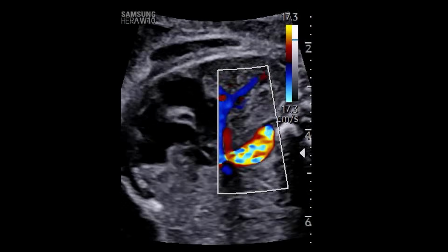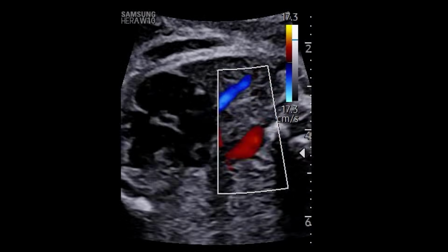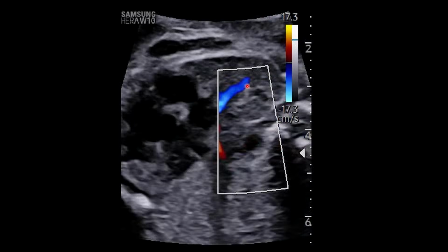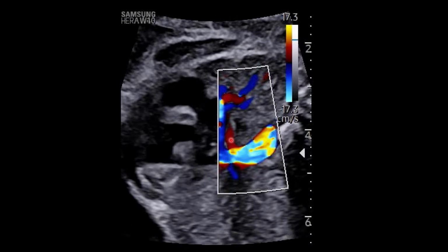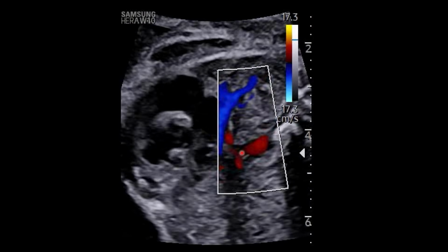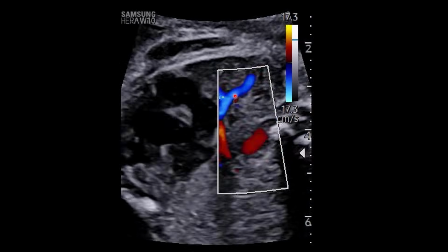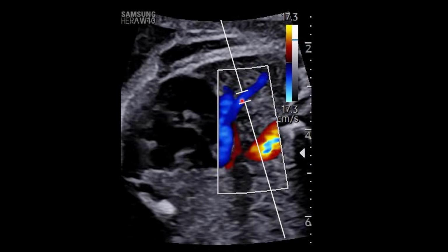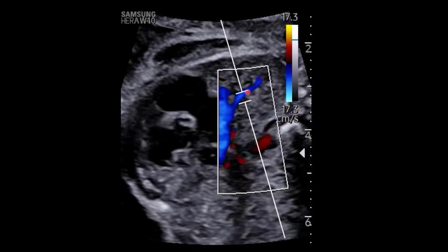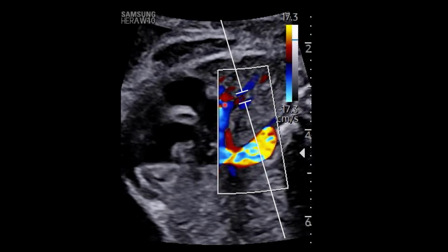Another method is the pulmonary vein, pulmonary artery Doppler method. And we see here in this sort of upswept 4-chamber view, the right pulmonary vein here. You can actually see the left pulmonary vein here, but we want to avoid this pulmonary vein due to possible contamination from this descending aortic signal here. And so the right pulmonary vein here is where we would place this slightly widened sample volume of our pulse Doppler. And you can see the red flash in there. That's the pulmonary artery, and that's the pulmonary vein, the blue there.